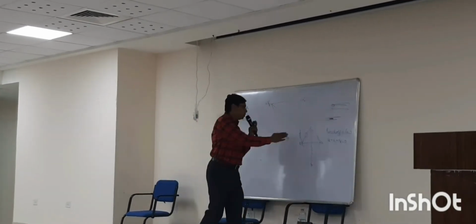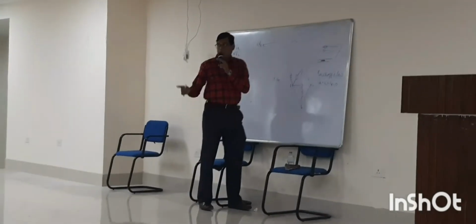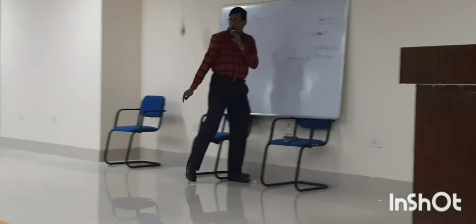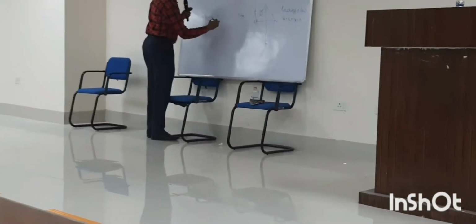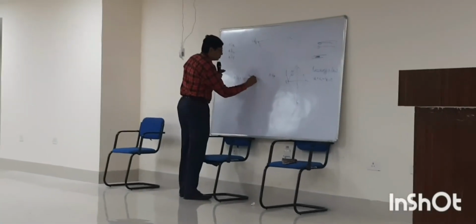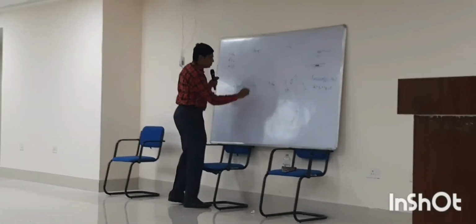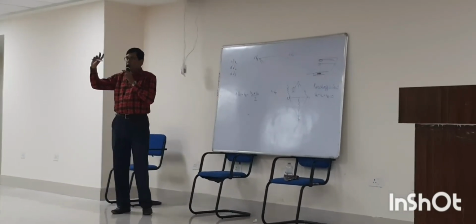So if this end is detached, what is the voltage of the common terminal? This will become the average.